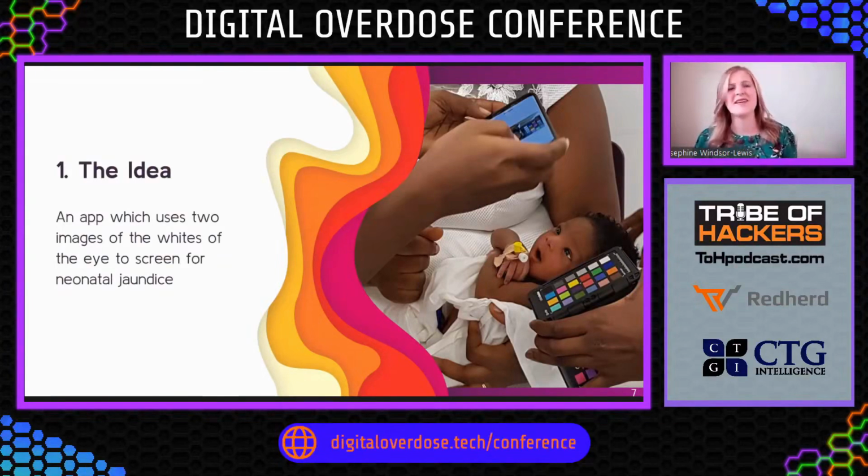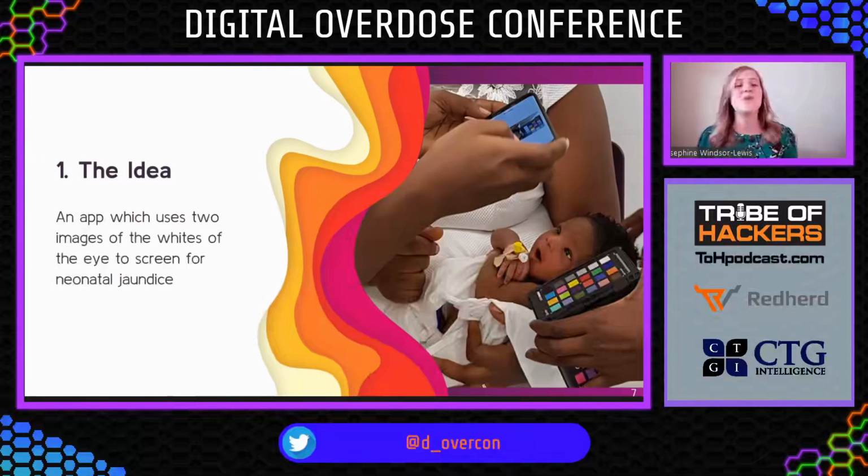I mentioned a pair of images here. There's a flash and a non-flash image. The reason we need to do this is because, as I'm sure you'll all be familiar with, if you sit under a blue light, everything around you starts to look blue. If you sit under a yellow light, everything will start to look yellow. That's the effect of ambient lighting, which can look really cool, but unfortunately isn't the best for accurate diagnosis. We need to get rid of this effect altogether.